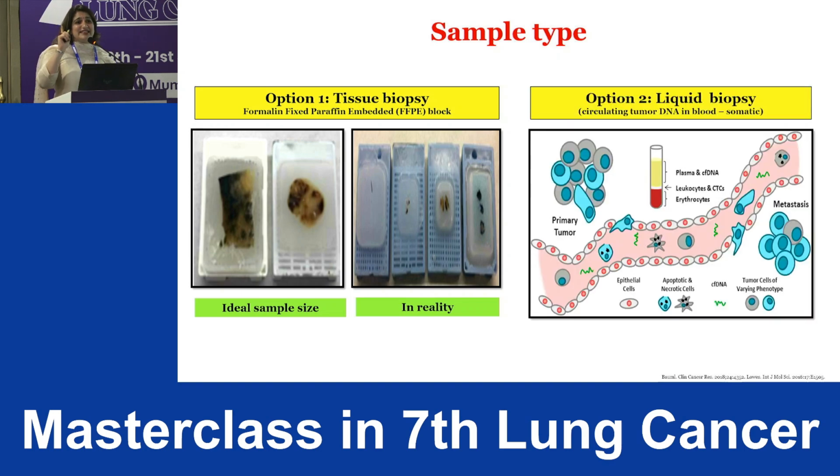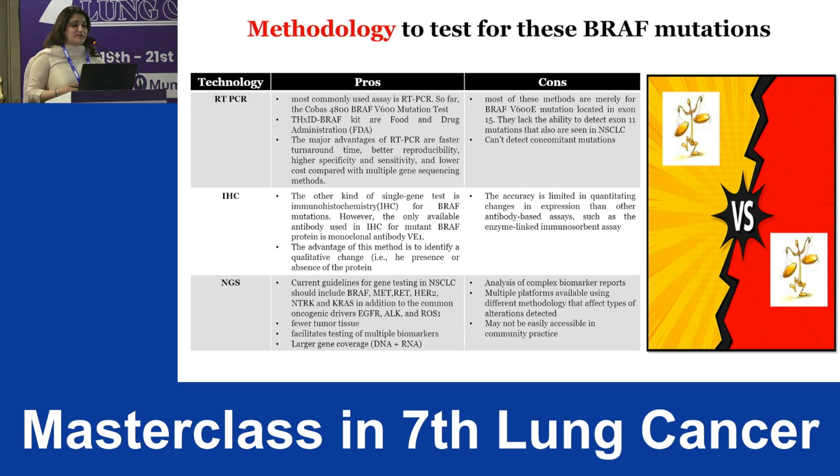And liquid, again, ctDNA. Now, when you're taking ctDNA, ensure that there's a 14-day washout period between the chemotherapy cycles. Another very important thing to note is that when we do this testing, if your tissue does not give you an actionable biomarker, as a reflex, please do a liquid biopsy. And if your liquid biopsy does not give you an actionable biomarker, do a tissue biopsy. This is as per the IASLC consensus, where they've actually seen that complementary testing does increase the uptake of finding a potential actionable biomarker. And do remember, lung cancer is heterogeneous by nature.